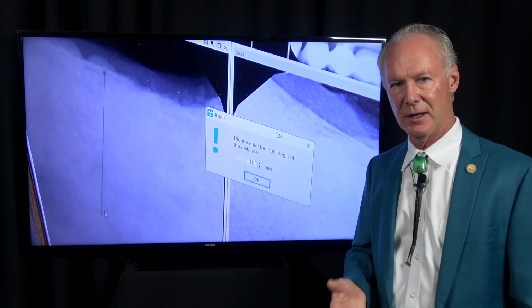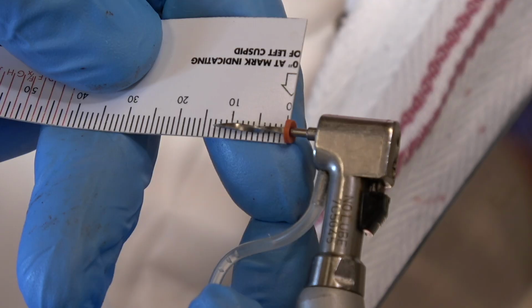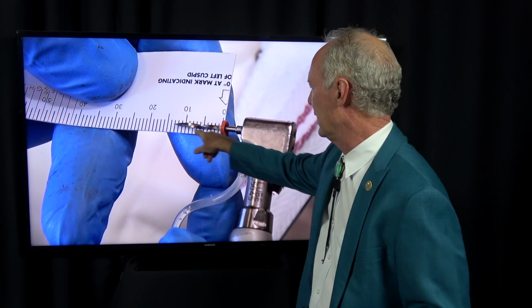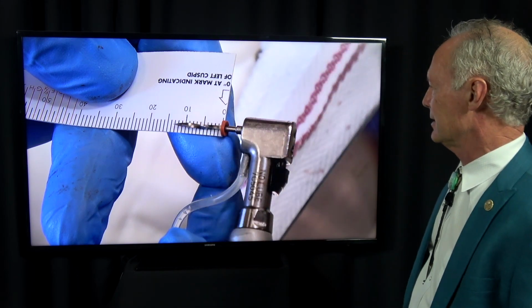Well, is an 18 millimeter implant in a case like this more stable than a 14? No. So I'm probably going to use a 10 or a 12. So this is at 12 millimeters. This is the pilot drill at 12. I know that's a safe depth.